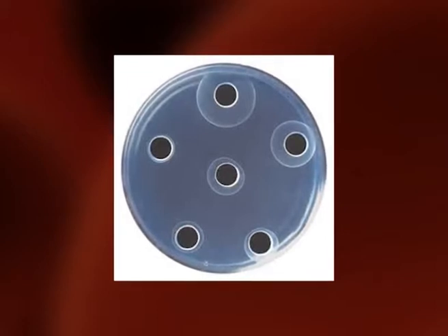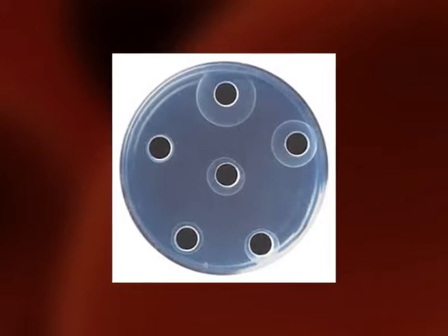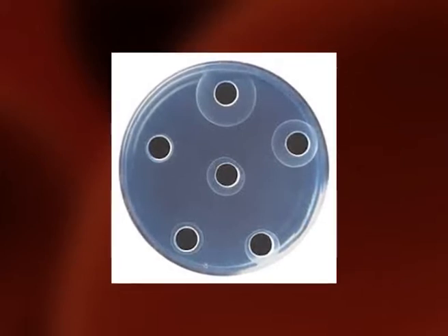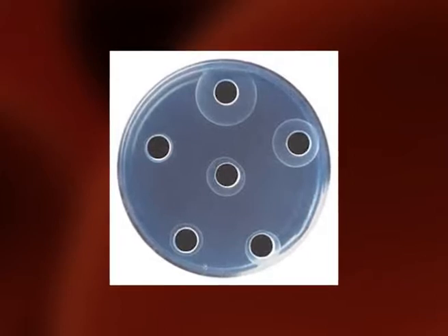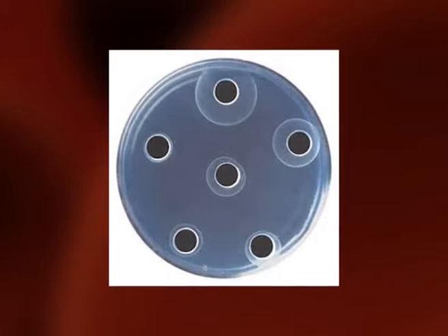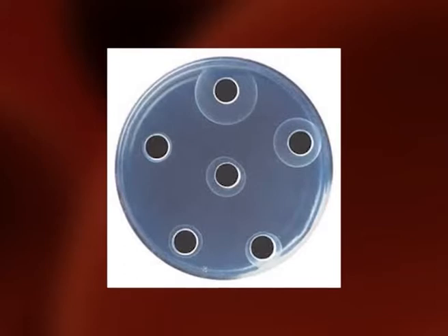Standards using known concentrations of antigen can be included in the same assay along with the samples, and a standard curve can be plotted. The amounts of antigen in samples can then be quantified by comparing the results with the standard curve.